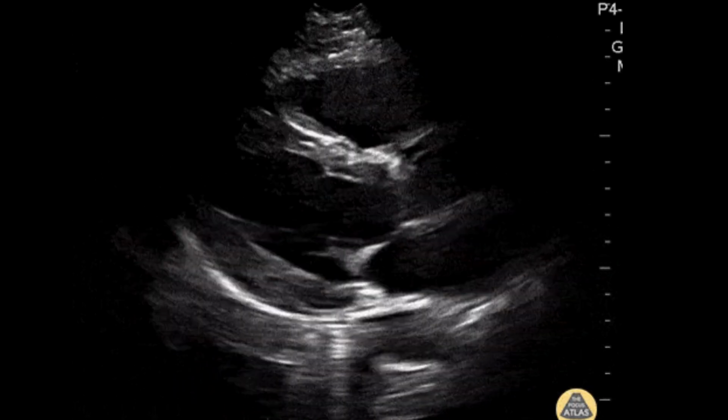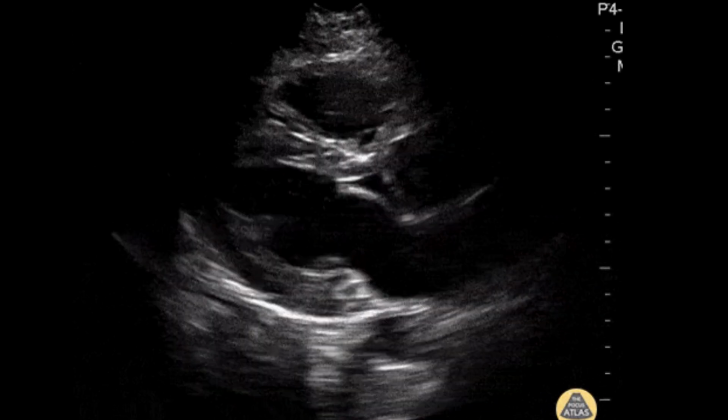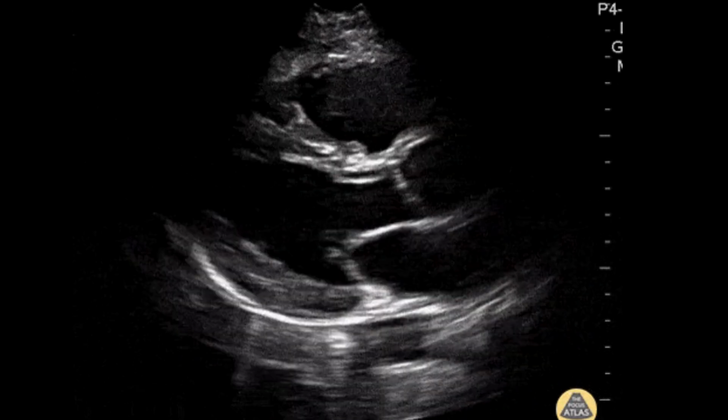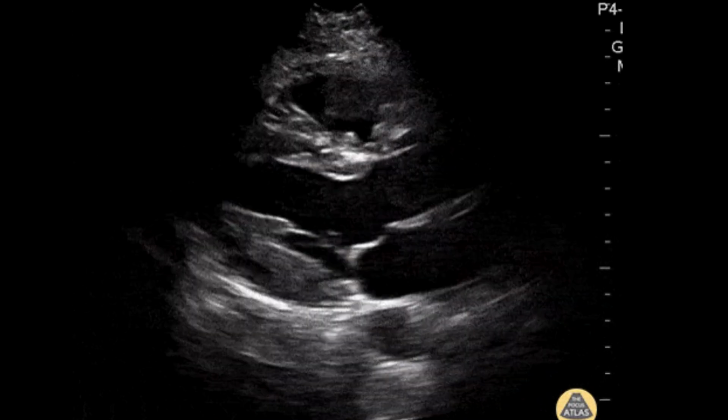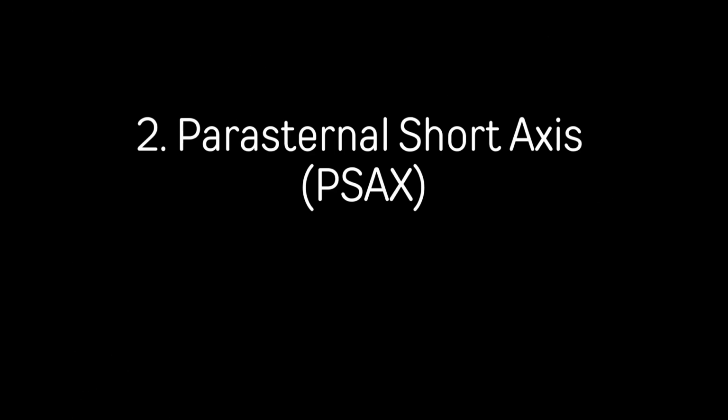But you can see that now. You can see, look, that contractility looks really good. The valves look supple, and as soon as something is wrong with the valve, usually there's a lot of thickening. It's quite white, so it's easy to see when there's something wrong with it.